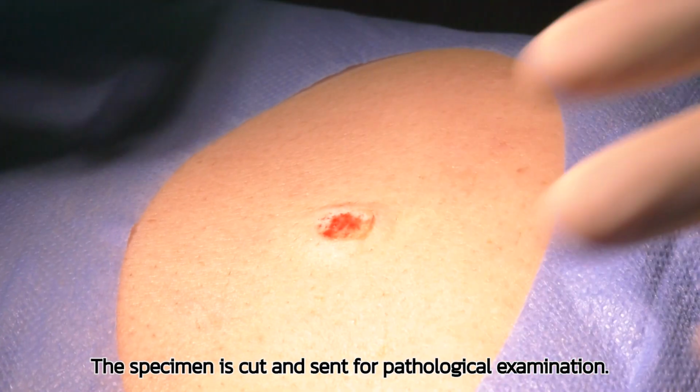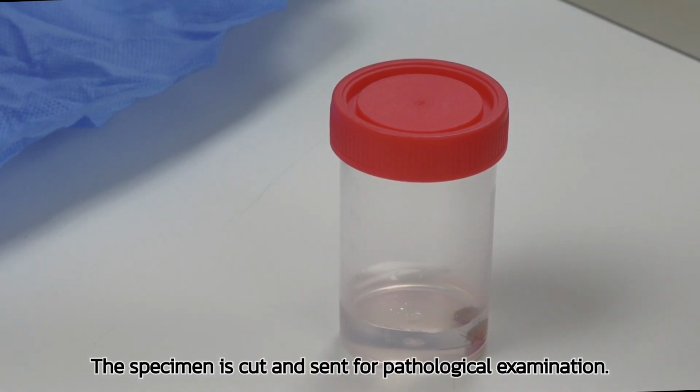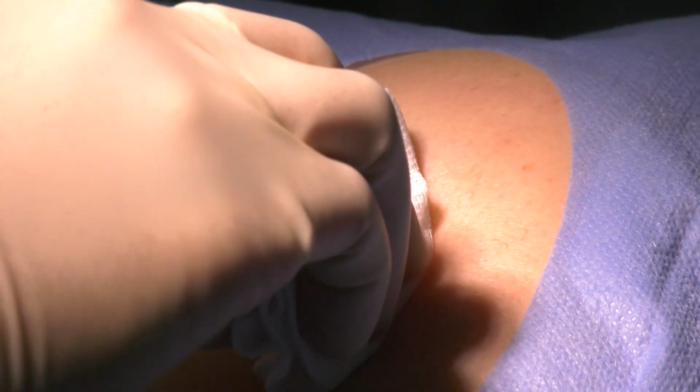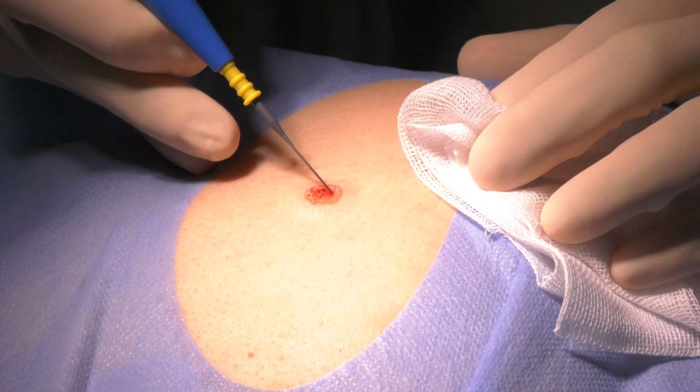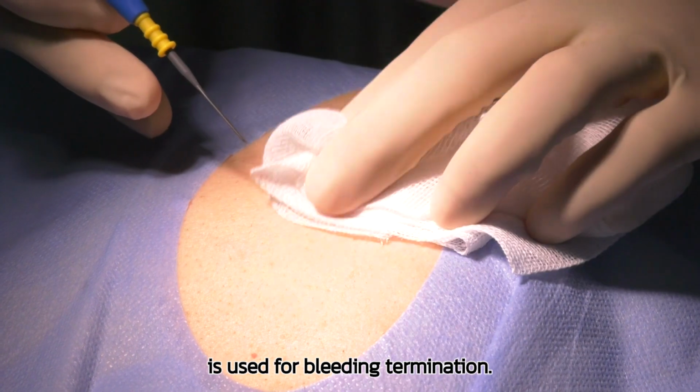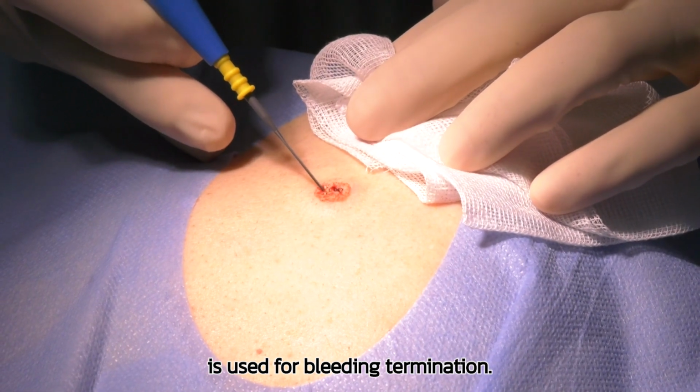The specimen is cut using scissors and it is sent for pathological examination. Aluminum chloride or electrocautery is used for bleeding termination.